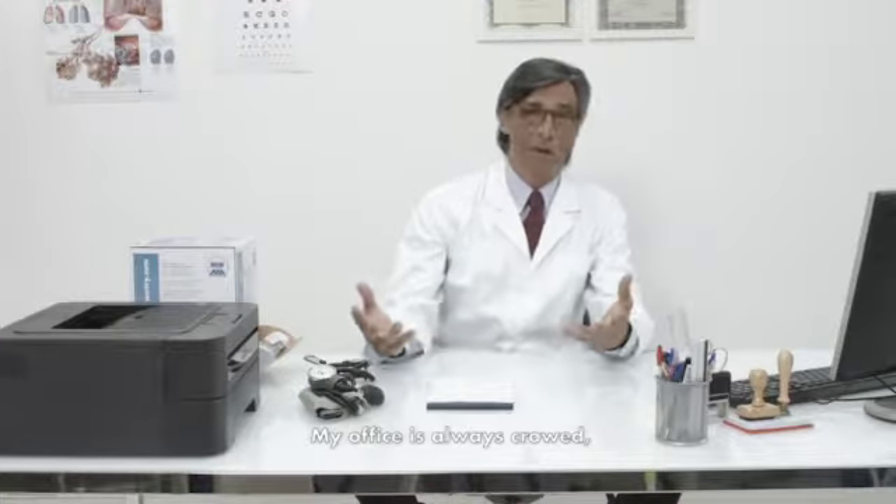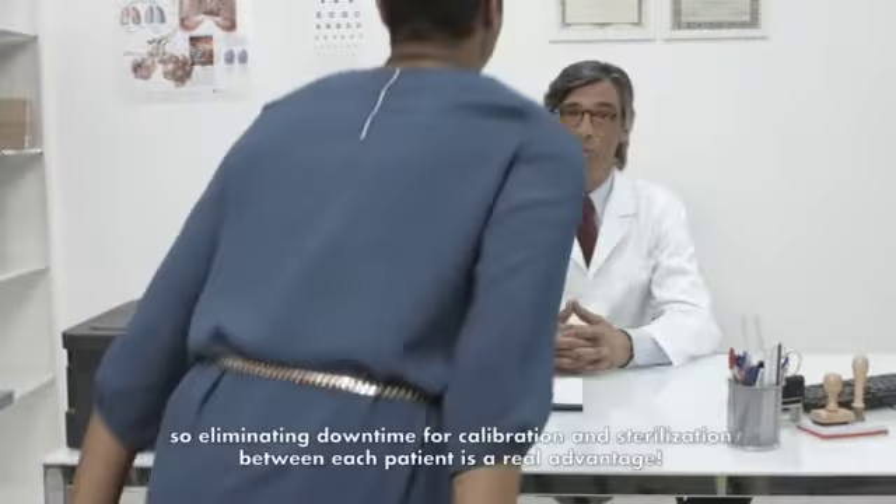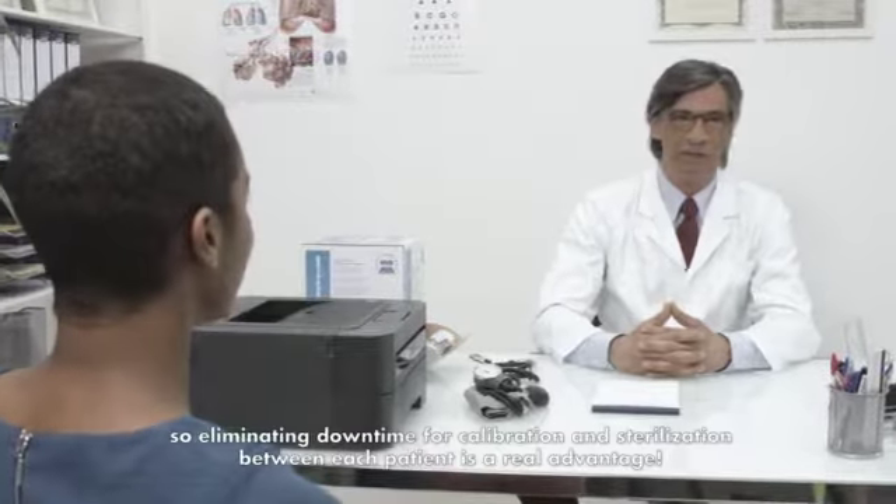I chose MIR SpiroDoc Spirometer as it is pocket-size, feature-rich, and versatile. My office is always crowded, so eliminating downtime for calibration and sterilization between each patient is a real advantage.